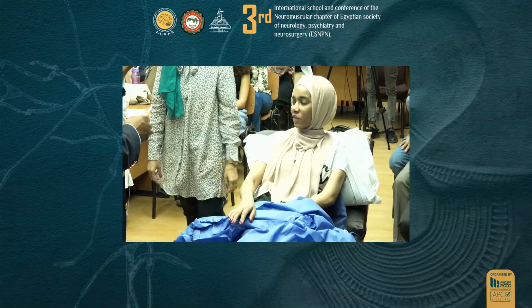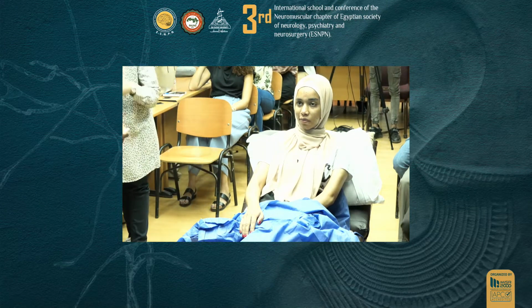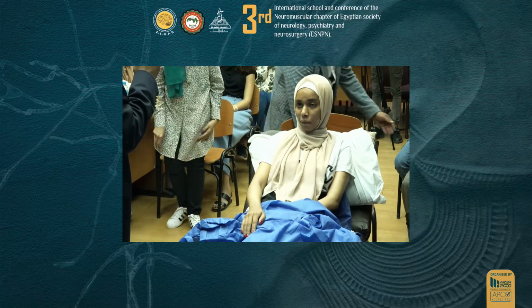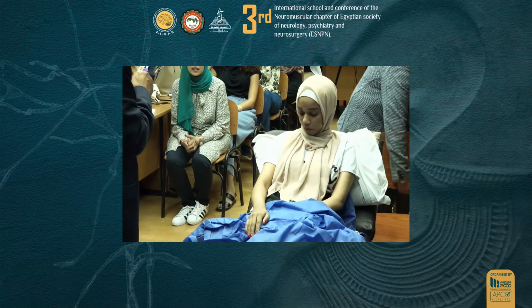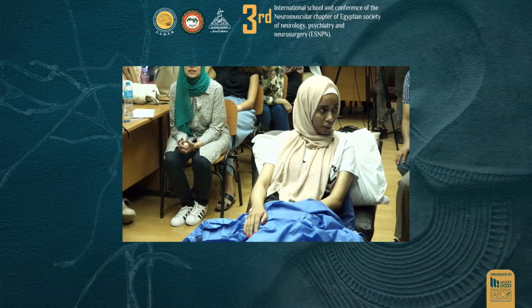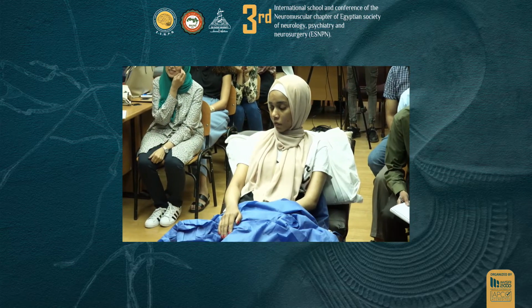Okay, inshallah. I can show you, it's a facial needle, it's very small. But the problem is it won't reflect. If you use it in the hand, it won't show you the true potentials. So for the arm, I use this middle size. And if you are a big guy, then I've got a bigger needle too, especially kept for big guys. So this one is a medium sized needle, okay?